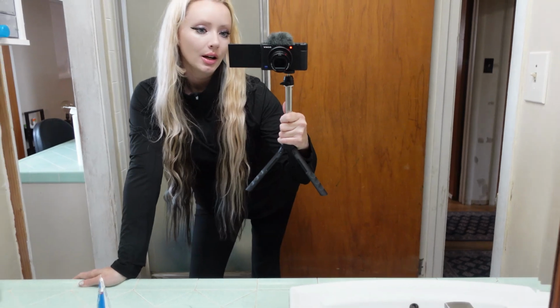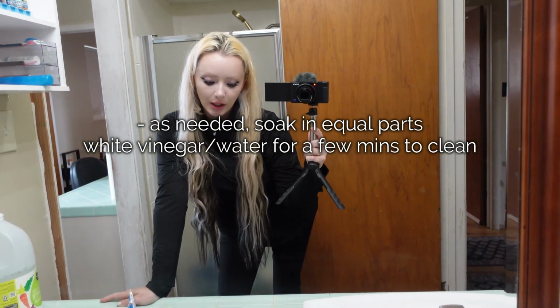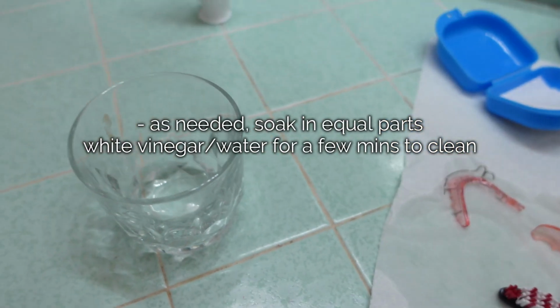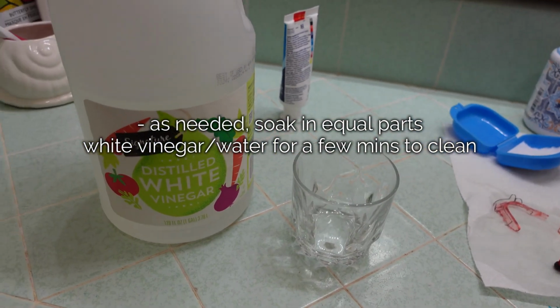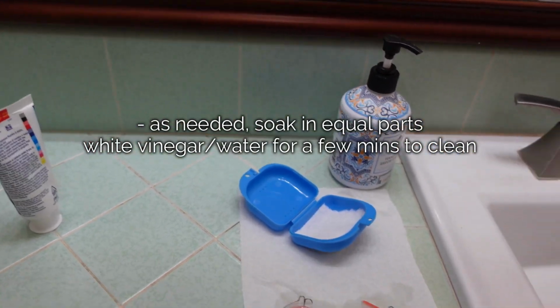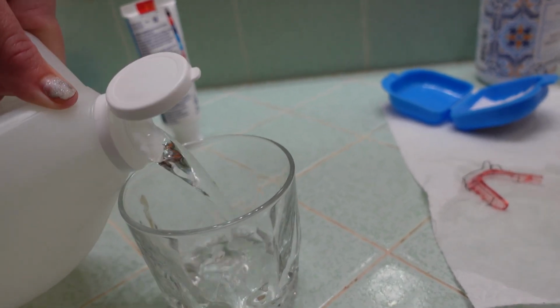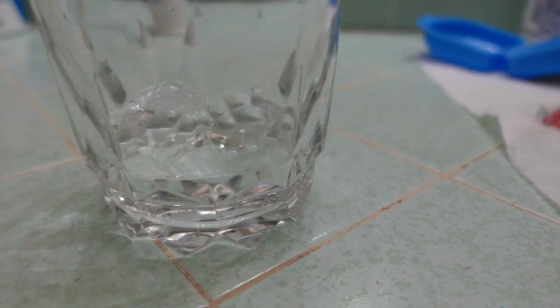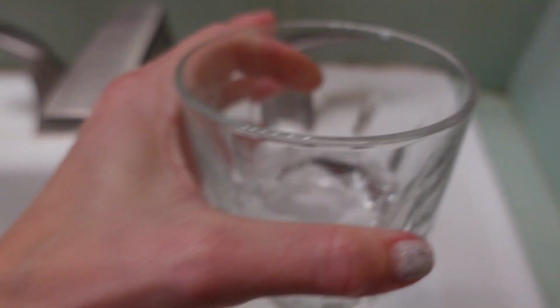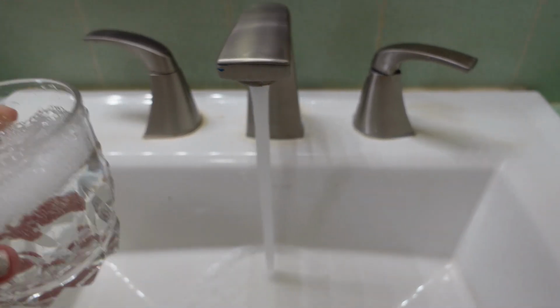Okay. Then I only do this about once a week, give or take, or whenever I just feel like it, but I'll just do this for the video. First, you want to put in half, or it's equal parts is what they say. It means basically, well, you know what that means, I guess. I put a splash, I can eyeball it. A little splash of, maybe a little bit more than that actually. I want enough for the retainers to obviously be submerged. And that's our equal part.